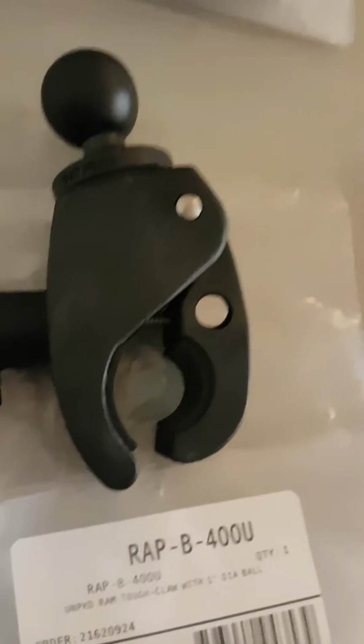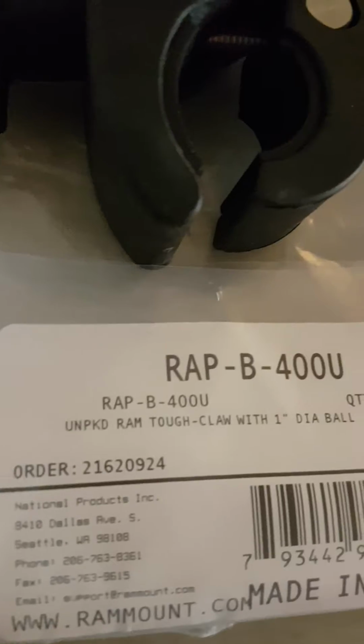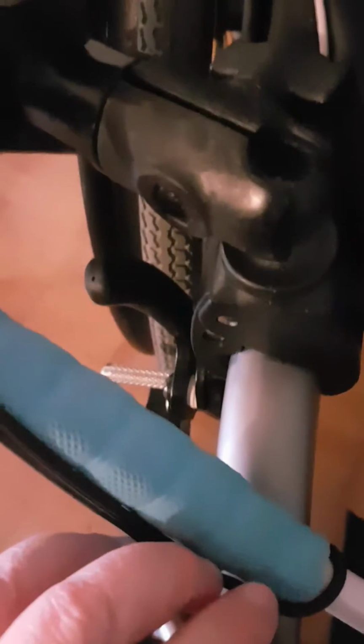And here it is again. Here's another version, the same clamp. And it's model number RAP as in Peter, B as in Bob, 400U. Again, that's RAP as in Peter, B as in Bob, 400U. That's the part number for the Tough Claw clamp. And I also have one more Tough Claw clamp, exactly the same size and model, mounted to the tubing on my wheelchair. Just the seat tubing.